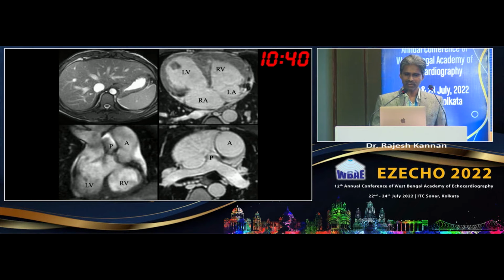We will identify the morphological LV by looking at the smooth ventricular septum as compared to the moderator band and the septal muscle, papillary muscle attachment on the septum on the RV side. So the LV septum will be more smooth, suggesting that there is an atrioventricular discordance.